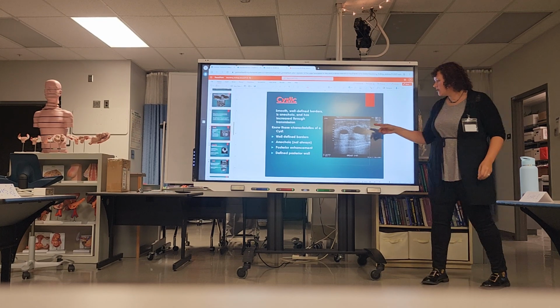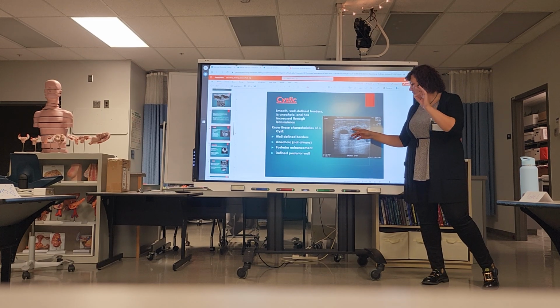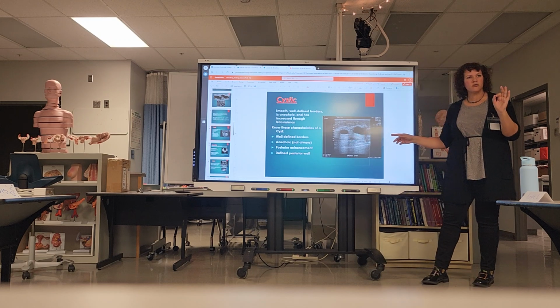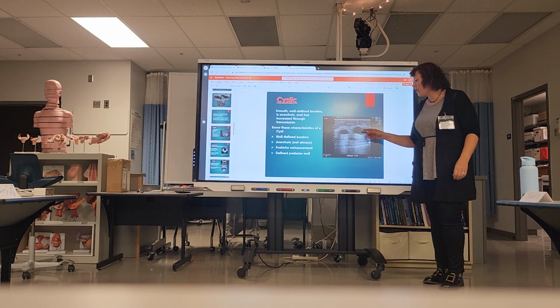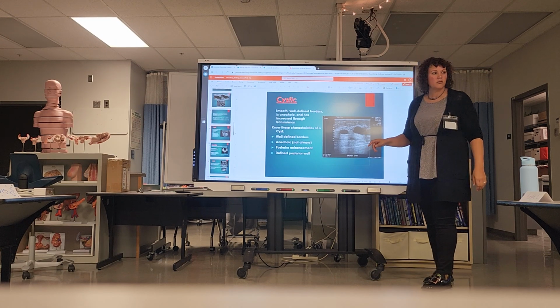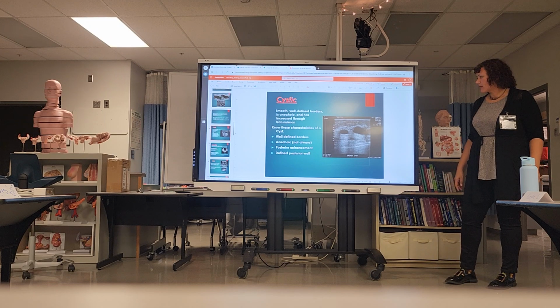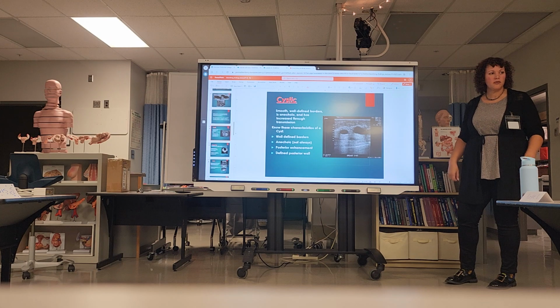If it's normally just a fluid-filled structure and you have echoes in it, it's no longer anechoic. Anechoic means there are no echoes inside of it. So what would you call it? You can call it a complex fluid collection. So it's no longer simple. Now it's complex because there's something going on.